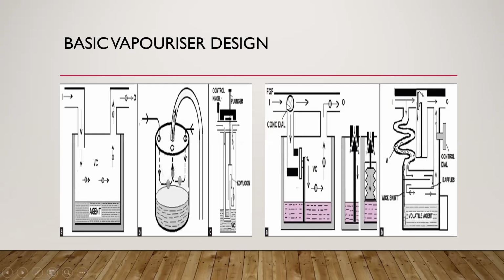What it does is split your fresh gas flow into two parts. One goes through the vaporizing chamber, and the other goes through the bypass chamber. So at the end of the day, the vapors from your liquid anesthetic agent join your fresh gas flow, reducing the concentration of inhalational agent that is eventually delivered to the patient. Does it make sense?